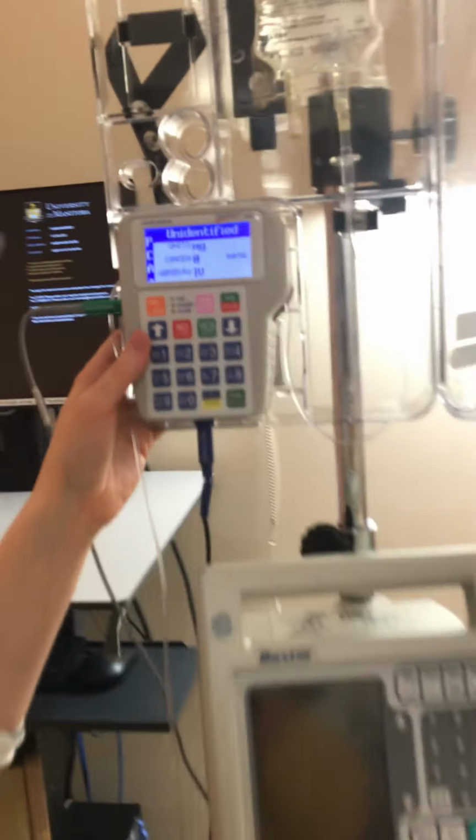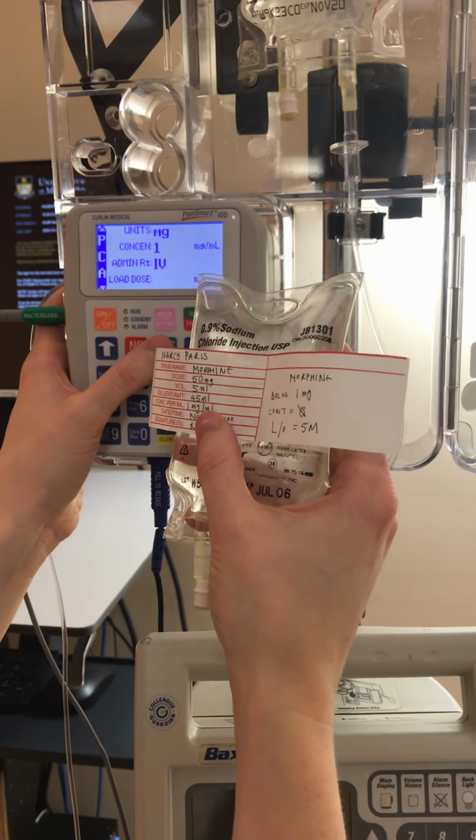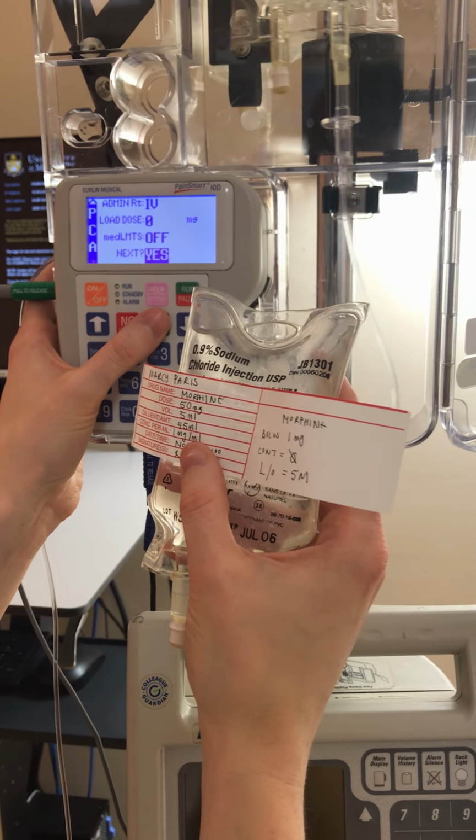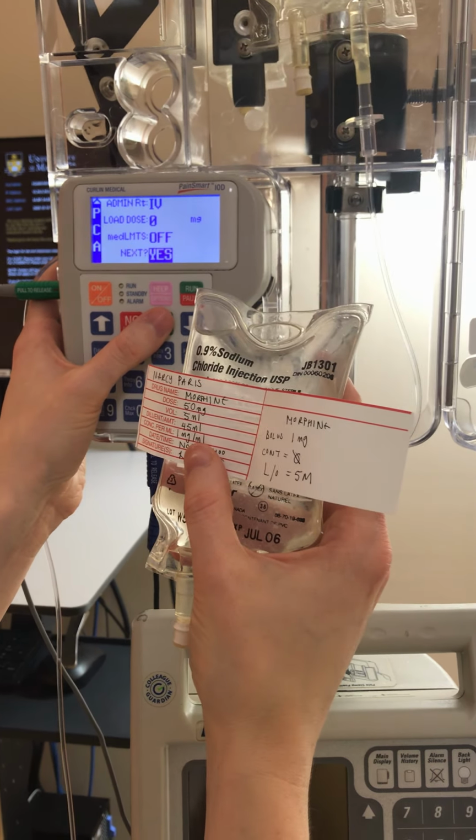So the units are in milligrams. I'll be giving 1 milligram per milliliter. The final concentration is going to be 1 milligram per milliliter. The route is IV, we know this. There is no loading dose. And there are no med limits right now, so we're going to continue. The bag volume is 50 milliliters.